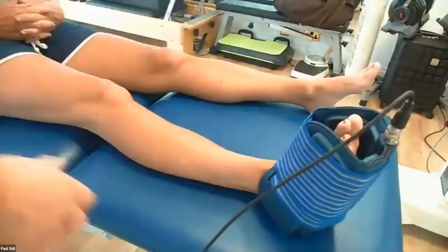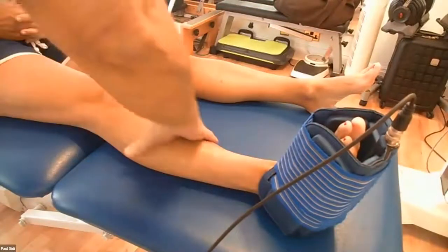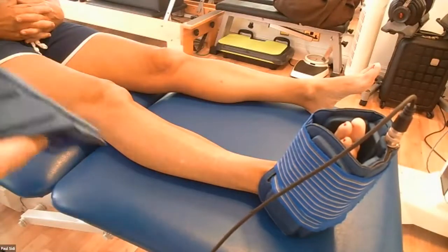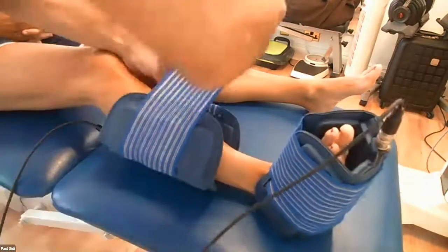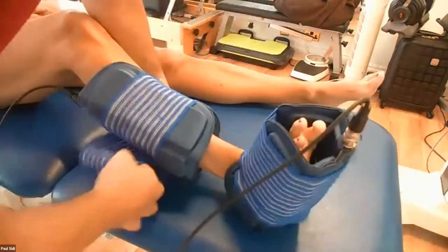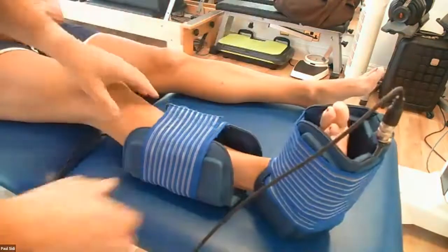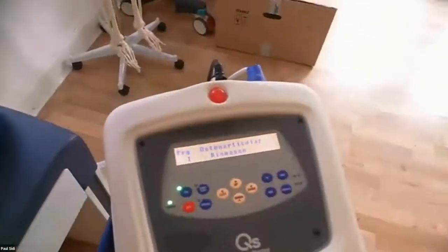And what I'll do as well, a bit like we always love to talk about the global thing, I'm going to get a bit of one round here, just to increase vasodilation around here. I'll put that up here and put that round. Right, so just relax down there. I'll just come across the machine. It is so simple. Can you see the screen there?